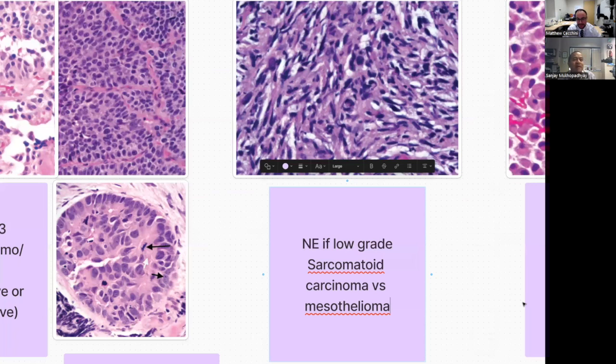And again, Matt, I'll put this scenario to you. Let's say you have this kind of tumor, clearly malignant, pan-keratin diffusely positive. And then I tell you the mass is a solitary 7 centimeter intraparenchymal lung mass. Will you call it meso with diffuse GATA? No, right? So the clinical setting can override even the most compelling immunostain, because where it is and what the imaging features are is so important.